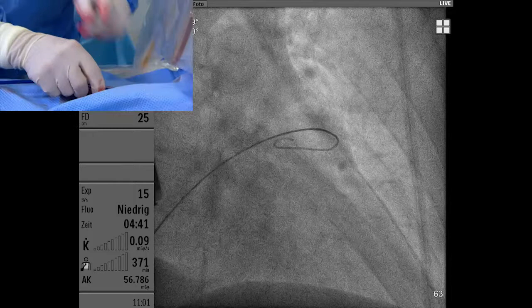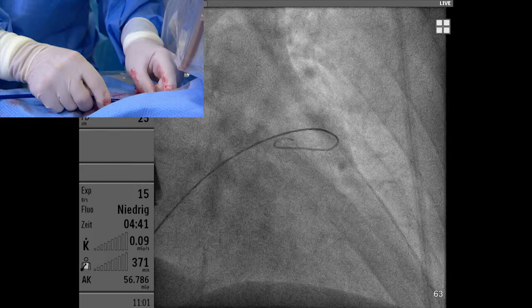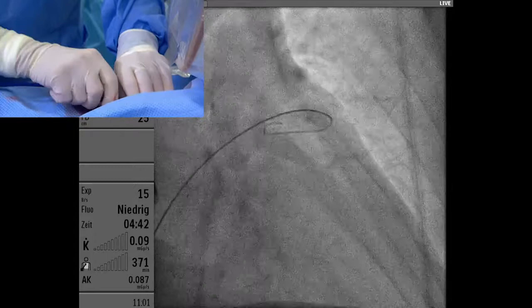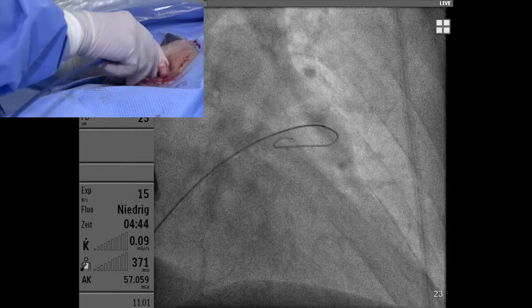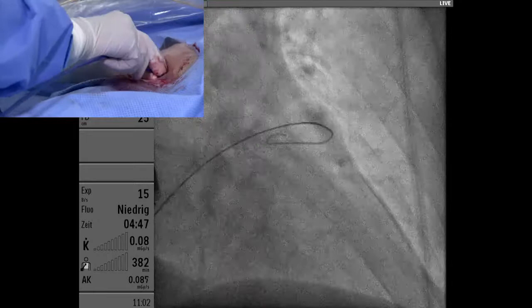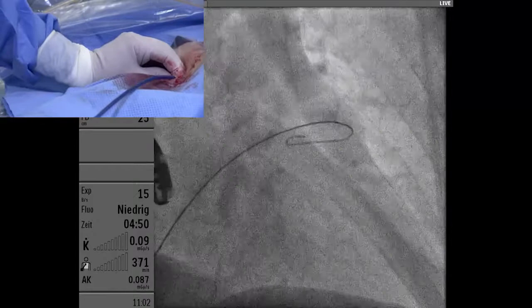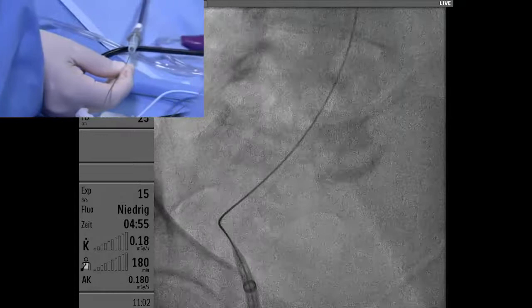When introducing the Amulet sheath through the groin, short movements are used always rotating in one direction — it's better not to go back and forth. Pre-dilatation is another option. The sheath is now in the vessel, though still not easy. In the cath lab context, exchanging in the left atrial appendage is comfortable, but for teaching others, using the left upper pulmonary vein is preferred for safety.